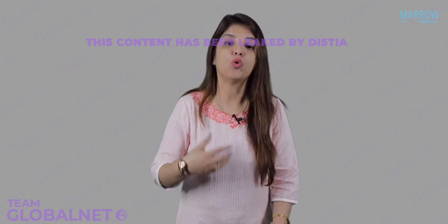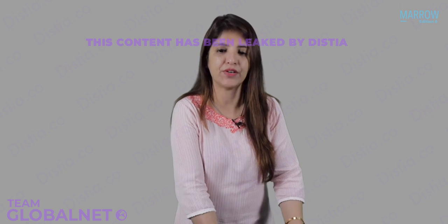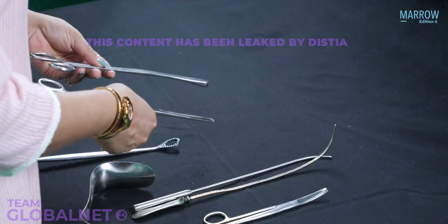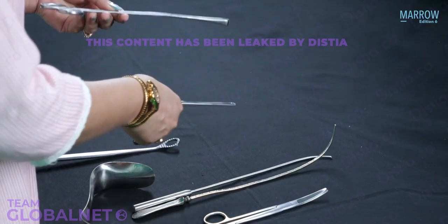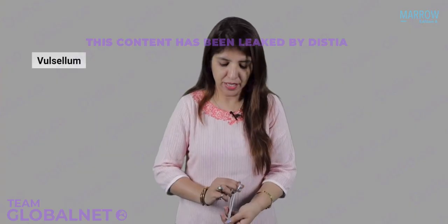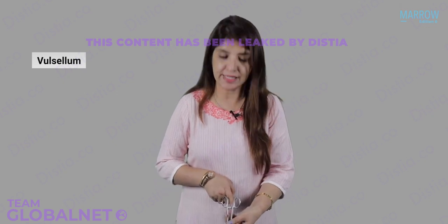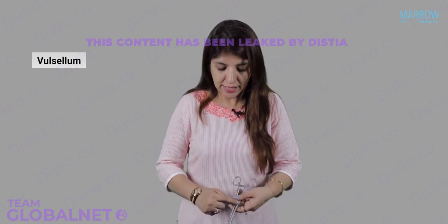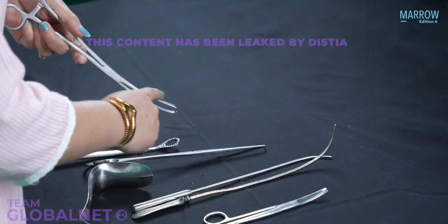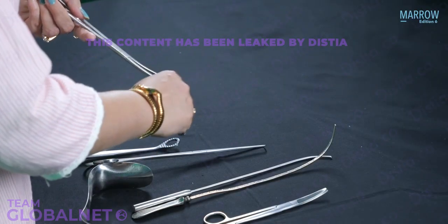Now I have to hold the anterior lip of the cervix, and to hold the anterior lip of cervix, I can use any of these 2 instruments. Now the instrument which is there in my left hand over here is a vulsellum. Now, a vulsellum over here, as you can see, posteriorly, it has a ratchet which is present. In the anterior part, it has a concavity which is facing upwards, and there is space between the blades.